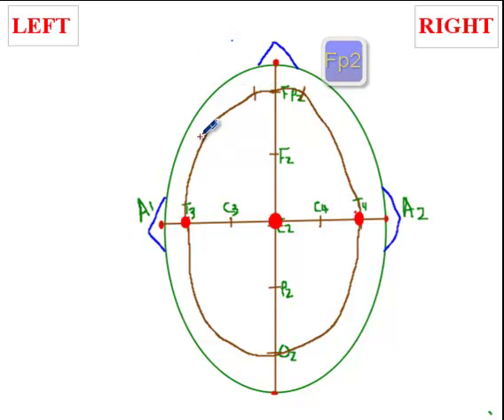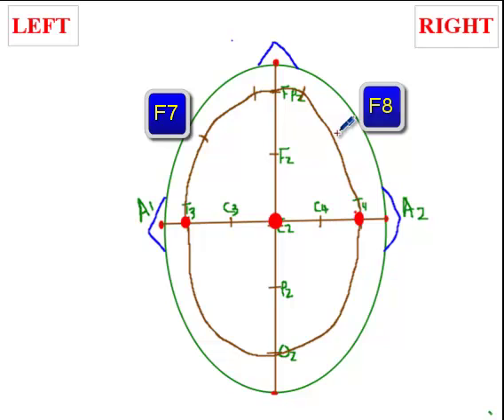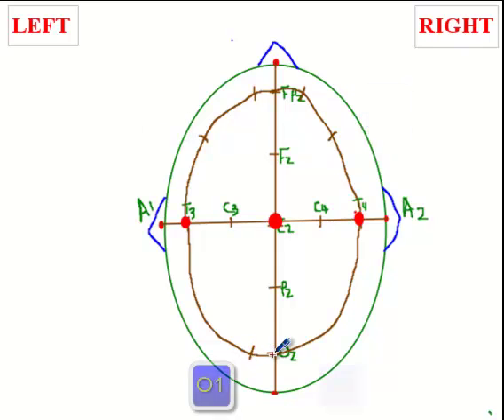Another 5% here. Between T3 and this mark, you put a second mark. And likewise, between, from OZ, you calculate 5% of the circumference and measure, put marks here. So, 5% is the 5% of this whole circumference that you have here.